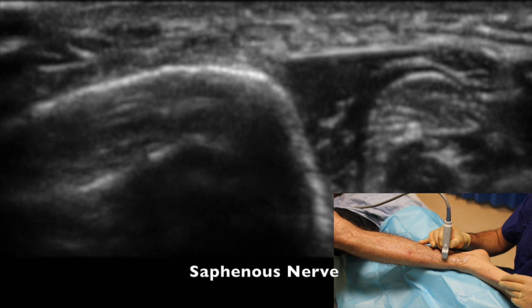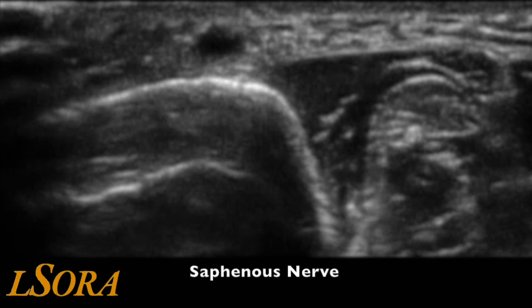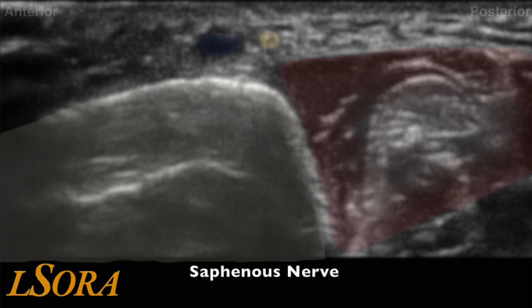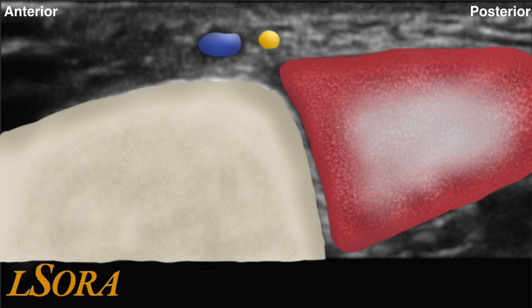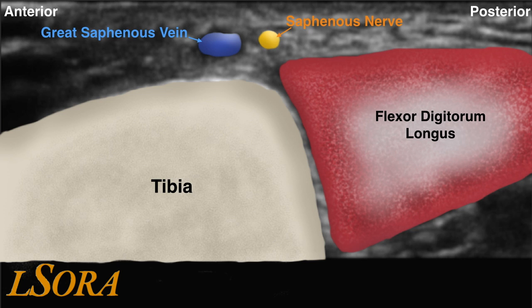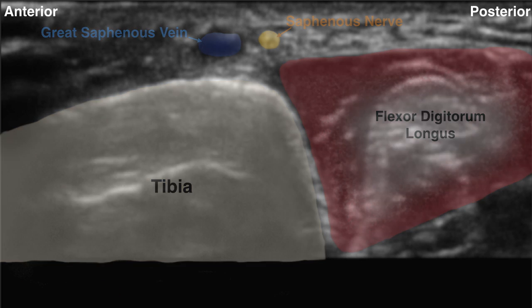To scan for the saphenous nerve, the probe is slid anteriorly over the tibia. The tibia or medial malleolus is identified, as is flexor digitorum longus. The great saphenous vein is seen lying extremely superficially under the skin and subcutaneous tissue. The saphenous nerve lies in close proximity to it.